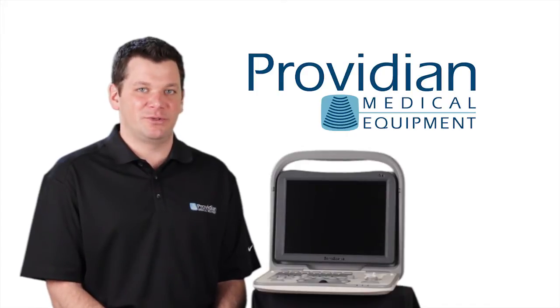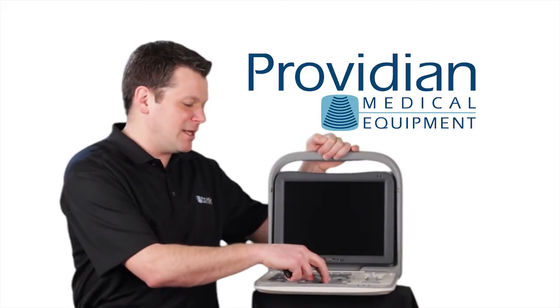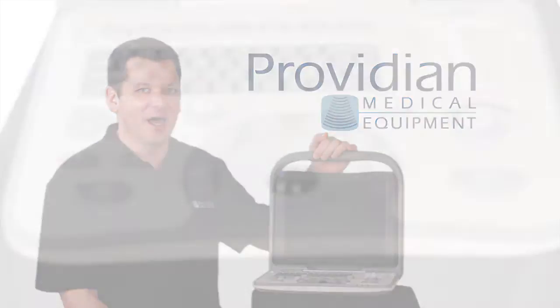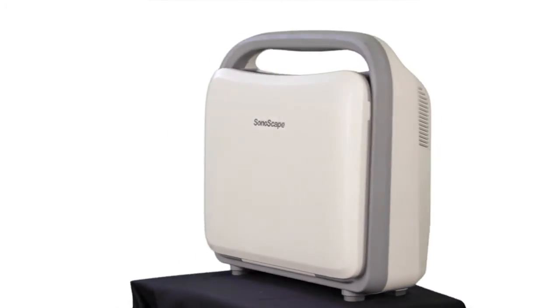This is a great ultrasound solution because it is easy to use. They've added a tilt monitor on it, you can export images very easily, the keyboard layout and everything is very simple, everything is right there in front of you, not a lot of hidden menus. The presets are pretty good and they do a nice job overall with this ultrasound machine.